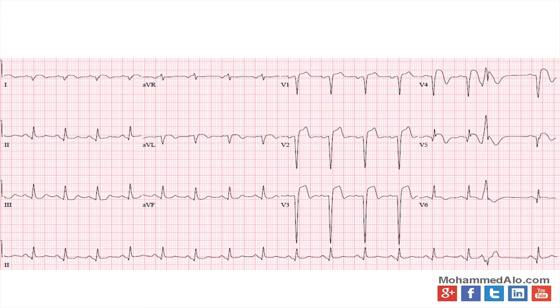If you look at the QT interval, usually 425 for an acute MI is your cutoff. This definitely looks longer than 425, the corrected QT interval. He's a bit tachycardic maybe, so that's why it looks a little off, but definitely looks abnormal. Now, if you're not sure, keep getting EKGs, plaster the wall with EKG paper, keep checking it over and over again until you get what you're looking for.